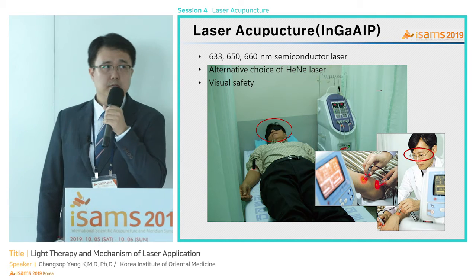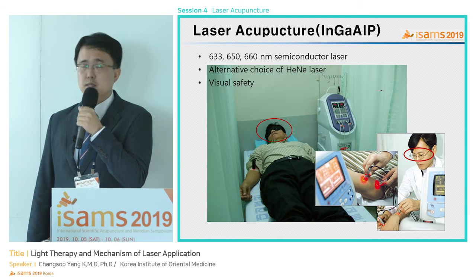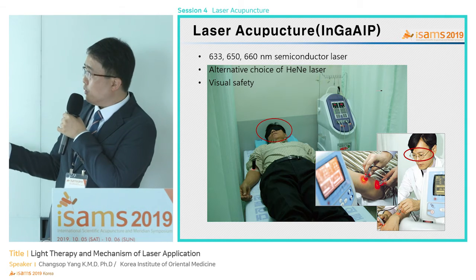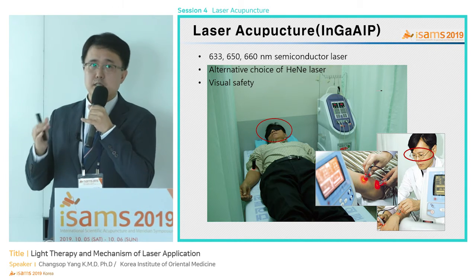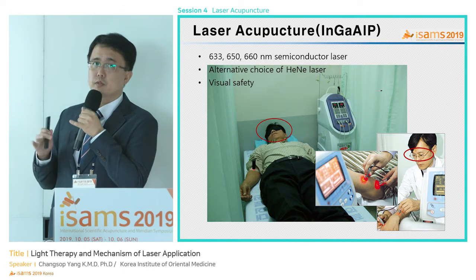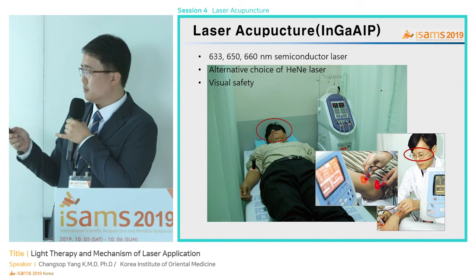This laser is visually safe and mainly has a power output under 50 milliwatts, which is a very low power laser. So we don't need to wear any protective eyeglasses. And this man has an eye patch. It's because in a blinded study, in the clinic, we don't need to use eyeglasses for the patient or the clinicians.